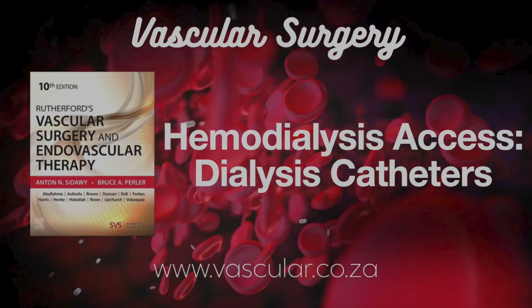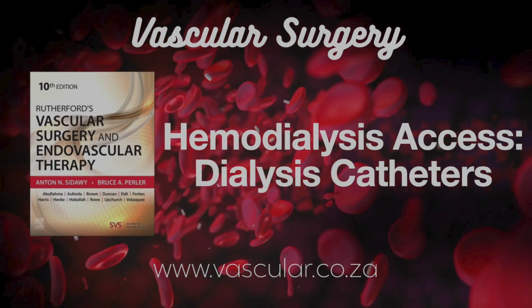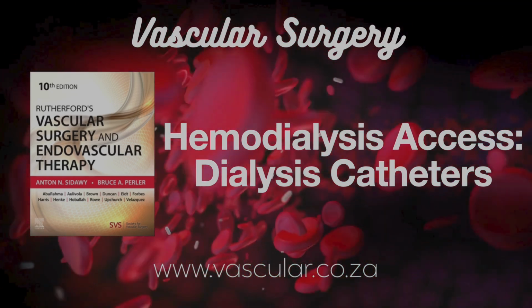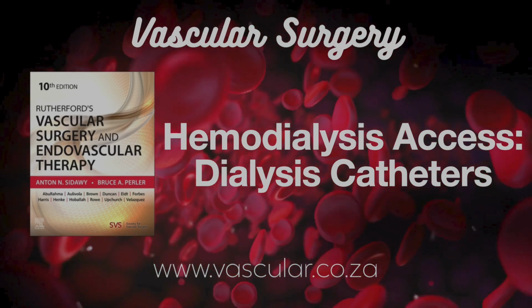Two primary goals, really. First, you need good blood flow. We're talking ideally somewhere around 300 to 350 milliliters per minute passing through the dialysis machine. That's essential for effective cleaning. Okay, high flow. What's the second goal? Minimizing recirculation. Recirculation, explain that.